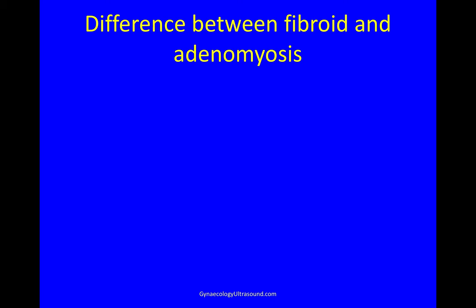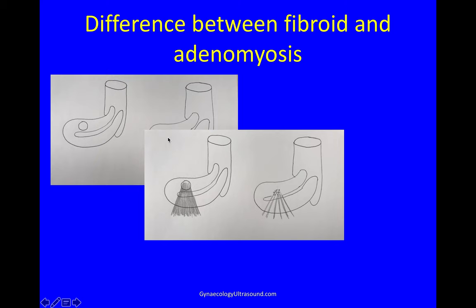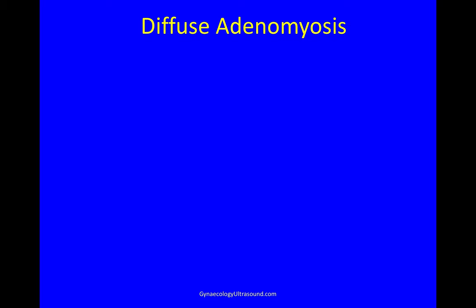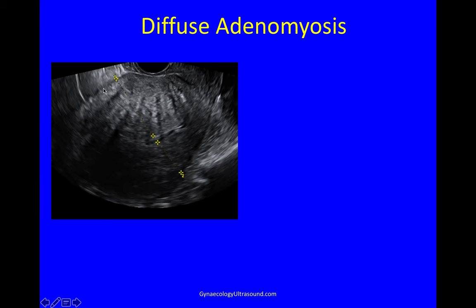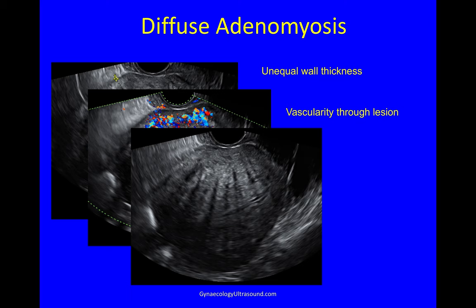The key difference between a fibroid and adenomyosis: a fibroid causes very dense posterior shadowing whereas with an adenomyoma you get more stripy shadowing — like light coming through a set of blinds, lighter, darker, lighter, darker. With colour Doppler you get circumferential flow typically in a fibroid, whereas the vessels cross the lesion in adenomyosis. In this example of diffuse adenomyosis, the anterior wall is much thicker than the posterior wall, the vessels traverse rather than encircle the lesion — no peripheral capsule — and there's that stripy shadowing typical of adenomyosis.